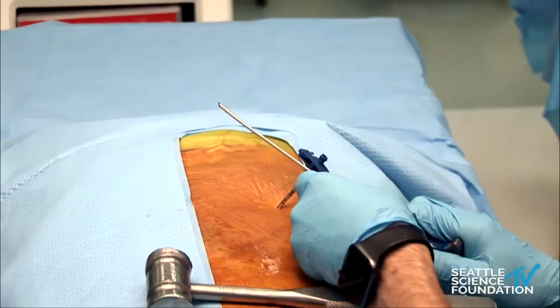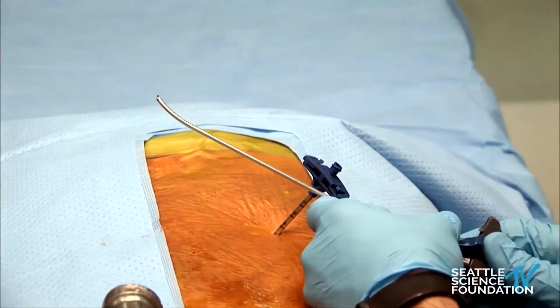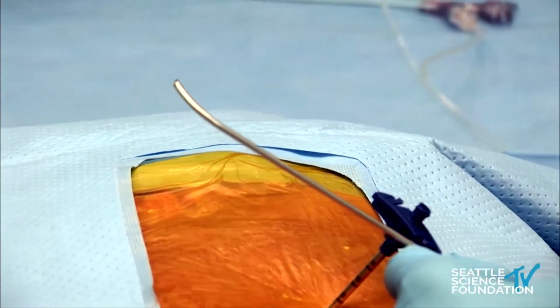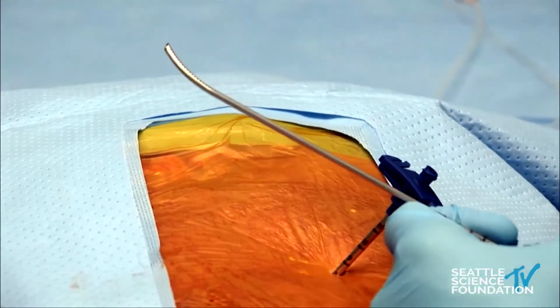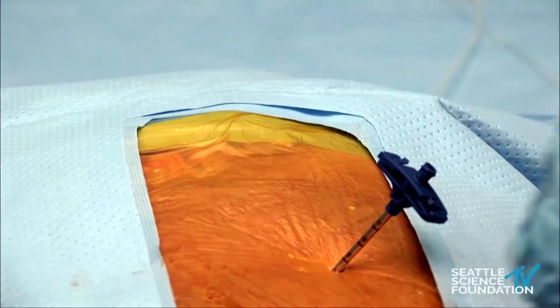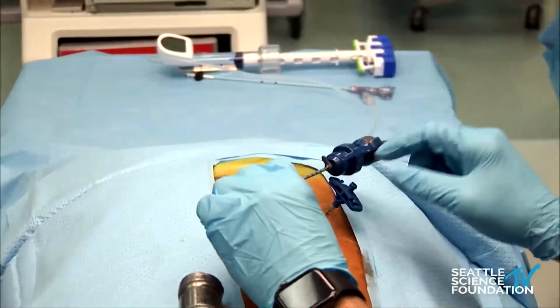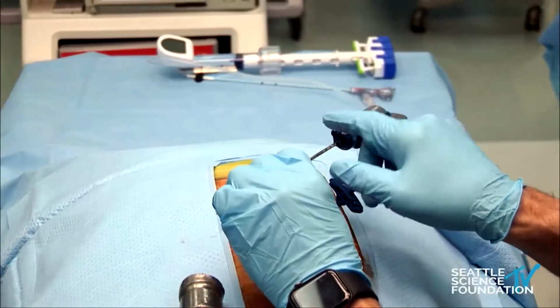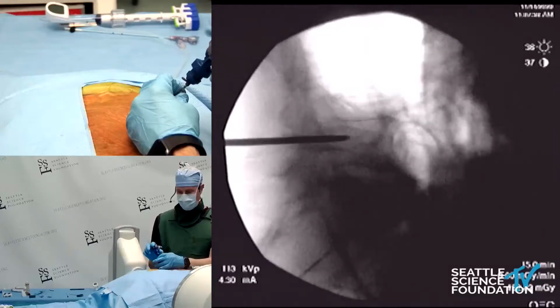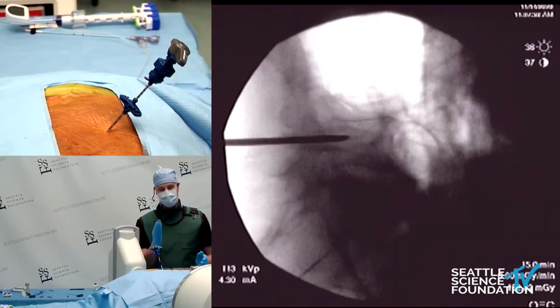So whenever the power curve is actuated, it steers the direction away from the face of the bevel, so it exaggerates the natural steering capability of the distal tip of the needle. And all of the indicators are proximal. And the direction is indicated by this small rubber arrow, so you can see where it's going. And so the direction here, with the approach at 9 o'clock, it's going to be directly across.